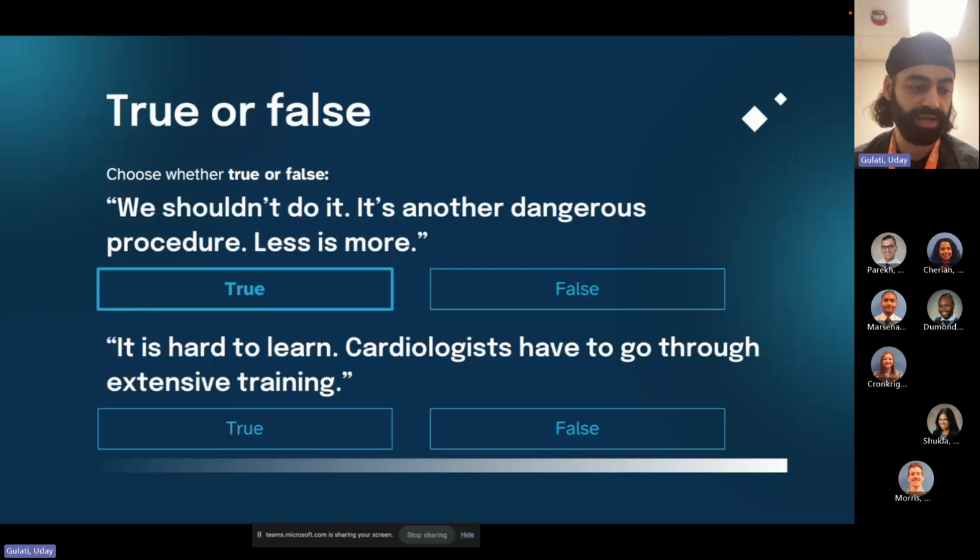They'll make sure they're proficient in transthoracic echo so they understand anatomy. They'll spend some time with the simulators, and once they're proficient with the simulators, they'll start doing real-life exams. For example, in one study, it was decided that it took about 30 good reports on a simulator before they let them do real-life patients, and within 10 good reports, they were deemed proficient on real-life patients. So pretty straightforward to do.